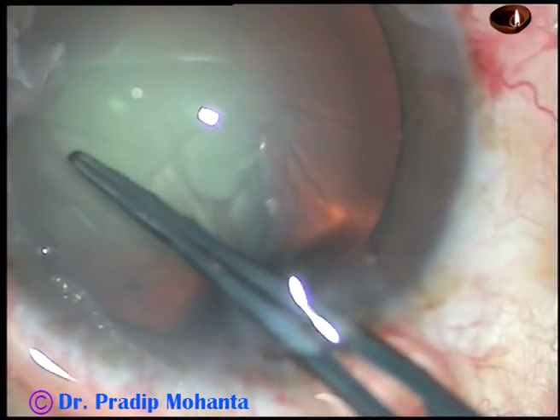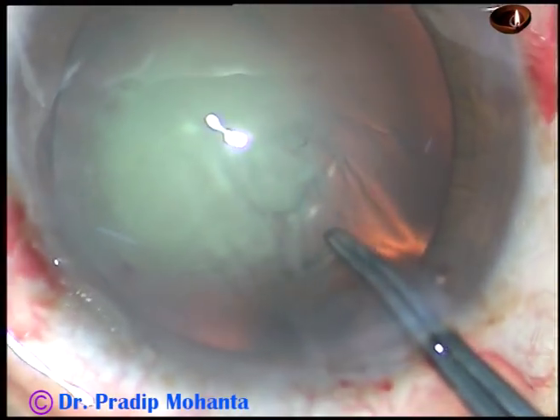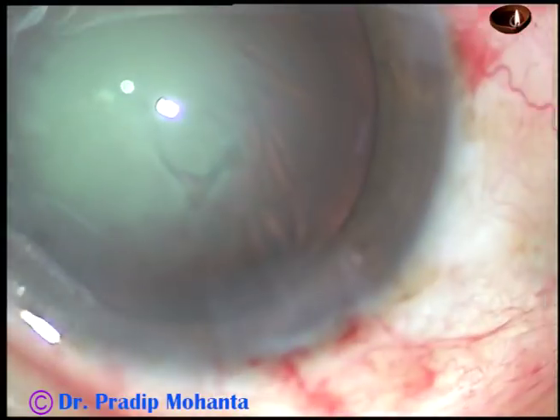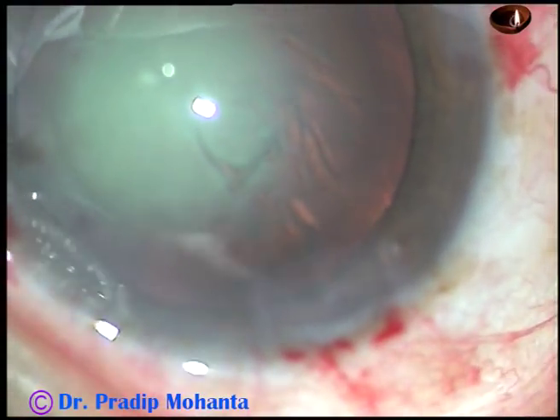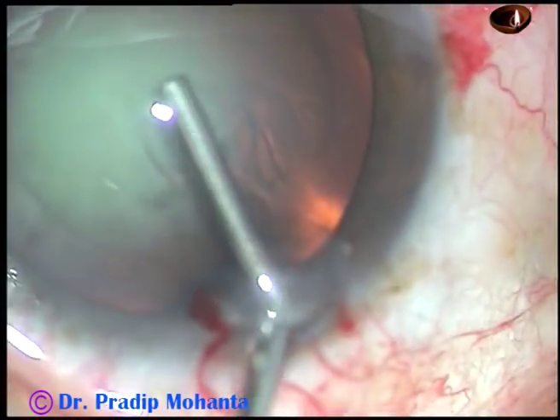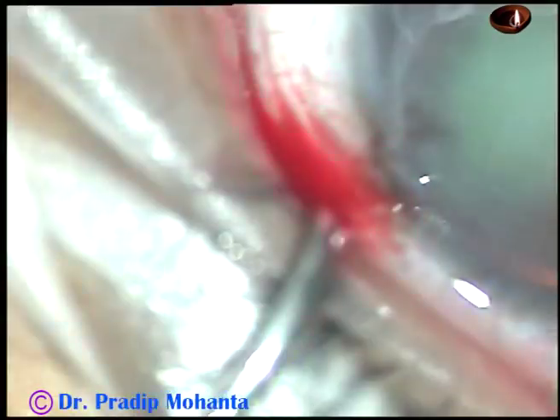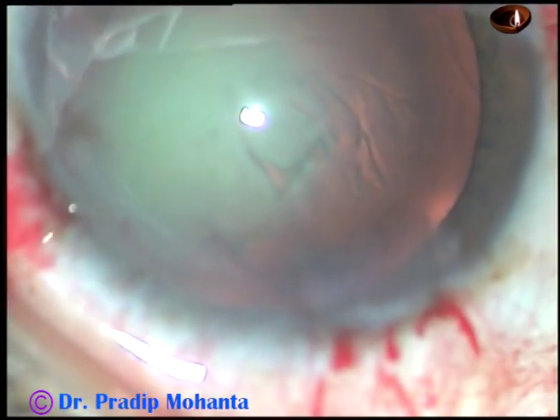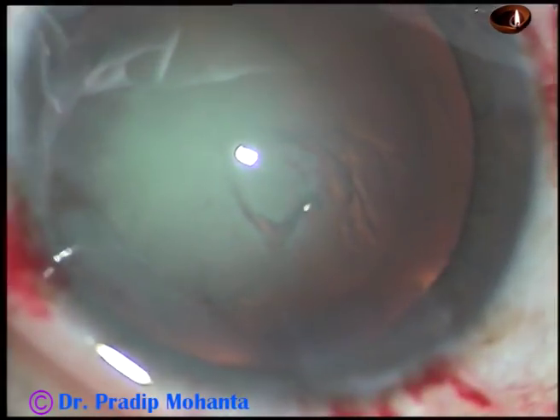Go all around, and thus I do a nice rhexis. And now in this case I am not going to do any hydrodissection. Little bit of viscoelastic substance has been injected, and now I am asking for the phaco handpiece.